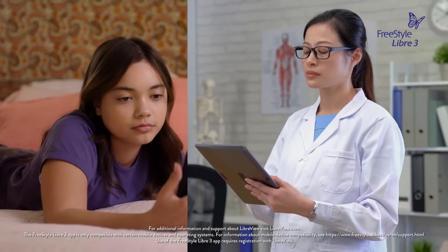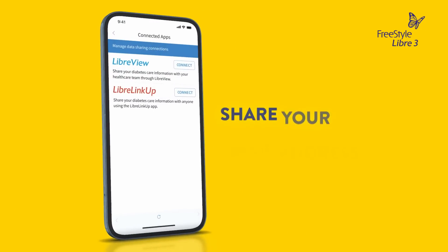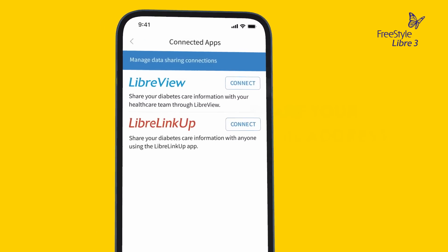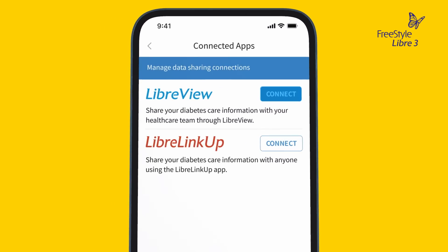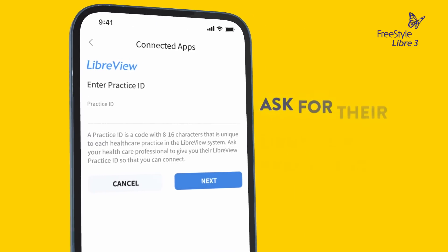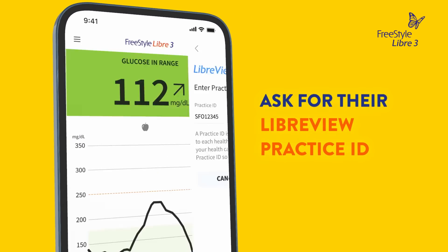There are two ways to do this. One is to share the email address you used to create your LibreView account with your doctor and ask them to invite you to connect. The other is to ask them for their LibreView practice ID and enter it into the Freestyle Libre 3 app.